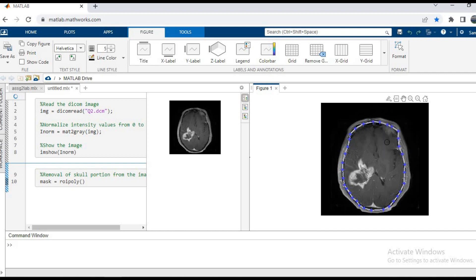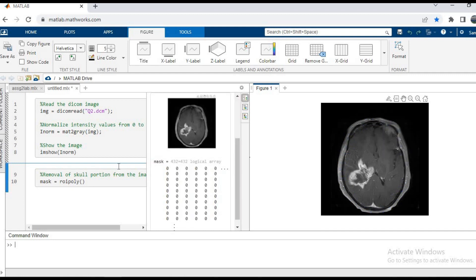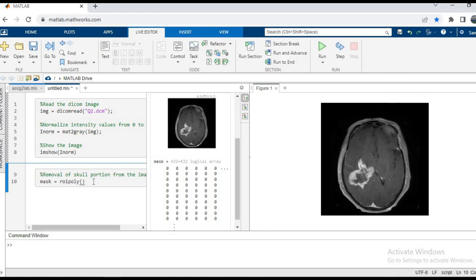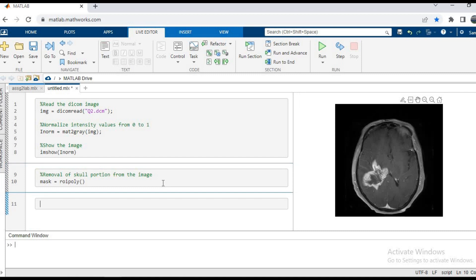This creates a matrix of the mask as we can see here. Basically the mask has all the values from 0 to 1, with the black areas being 0 and 1 being the white areas.